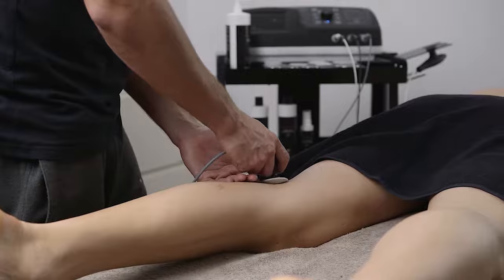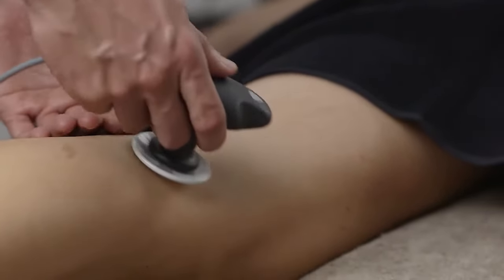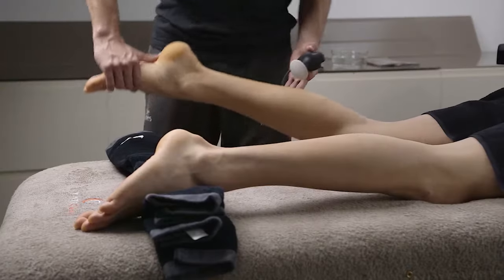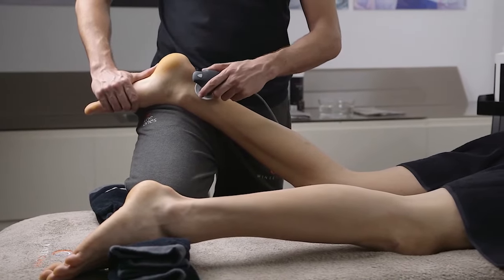The therapist who uses T Plus can influence the inflammatory process, the nociceptive response and biomechanics in order to promote accelerated rehabilitation and better body conditioning.